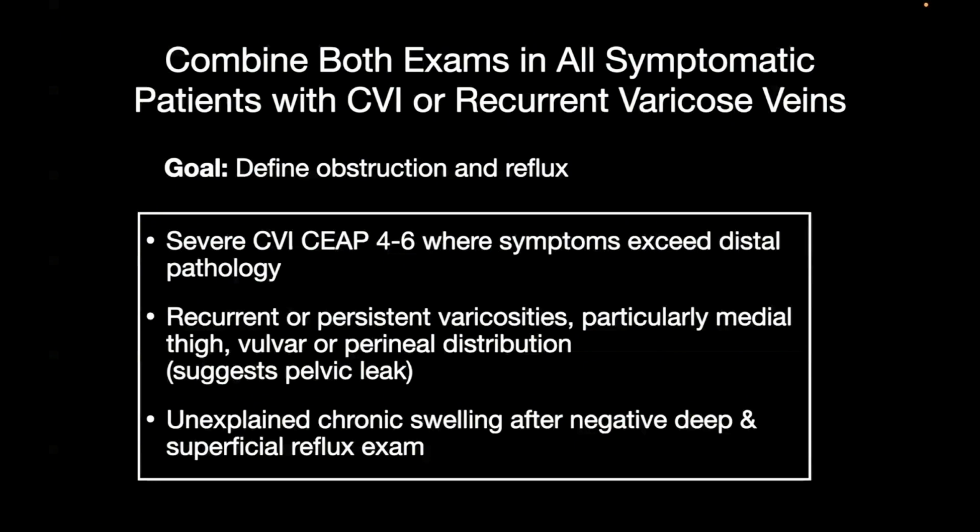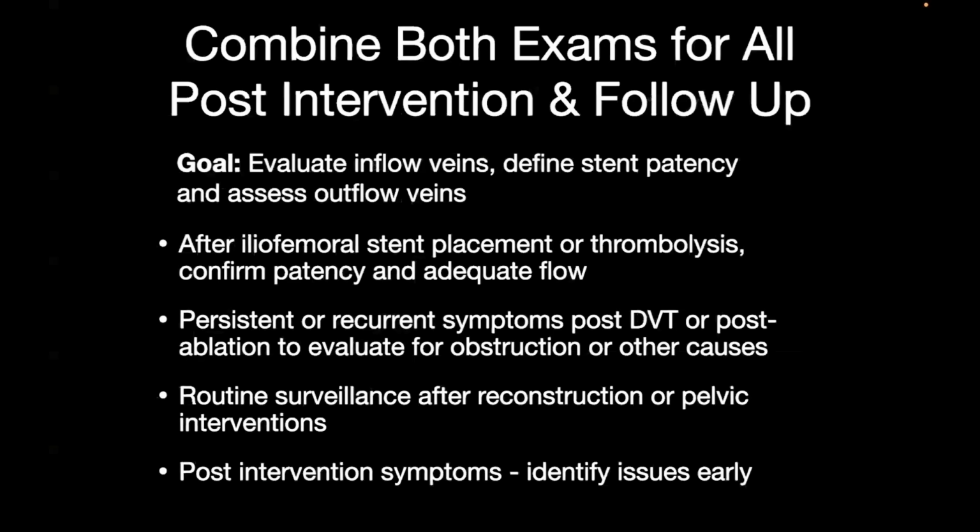If you have a patient that presents with unexplained chronic swelling and you did a very thorough, deep, and superficial standing reflux exam and it's negative, again, as long as that exam was done properly, going on the pretenses that there's got to be a reason, you want to look higher and investigate this. We also want to combine both exams for all follow-up post-intervention.